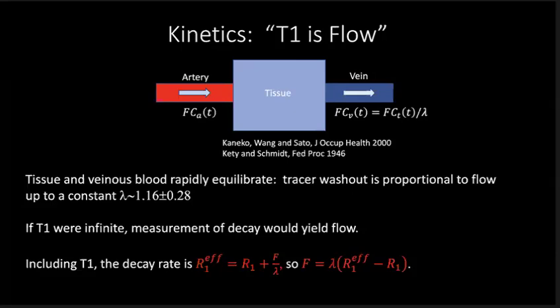but the T1 is related to the flow. Normally when you measure T1 in a hyperpolarized vial or whatever, you pulse away at it, look at the decay, and that's your T1. But here you've got tracer washout as well. So you've got the arterial input, which ends at some point. We actually apply some saturation bands to shut off the arterial input. That's a nice thing about C13. You can actually kill it when you need to. And then all you've got is signal in tissue and the signal in the veins.